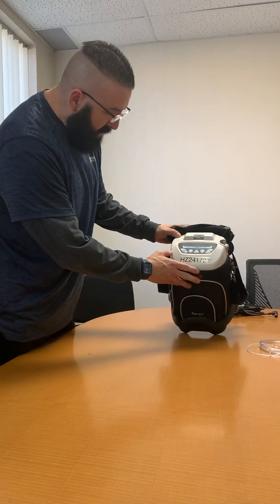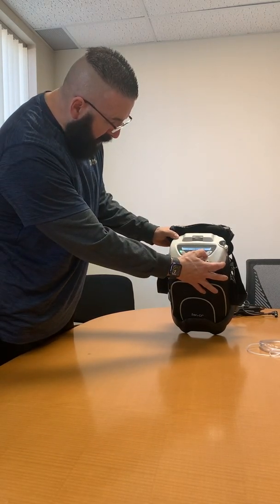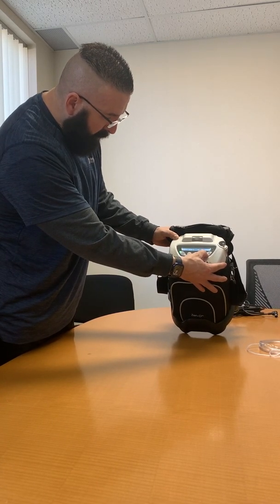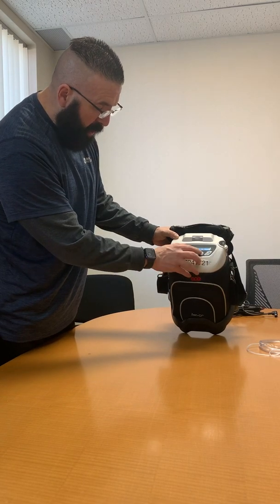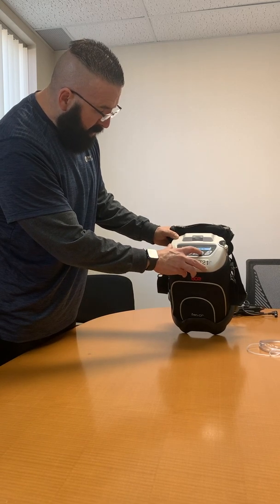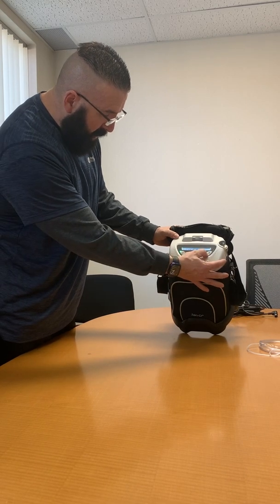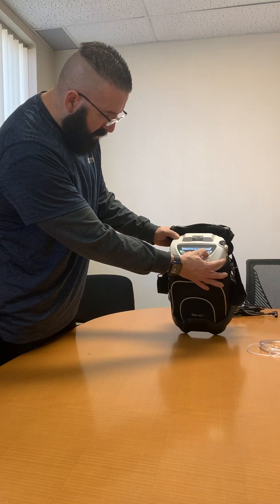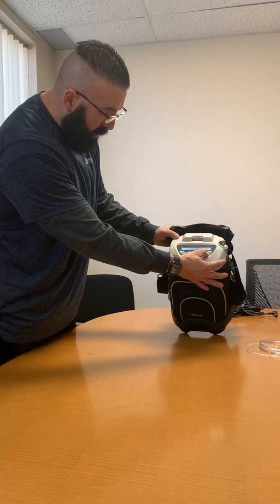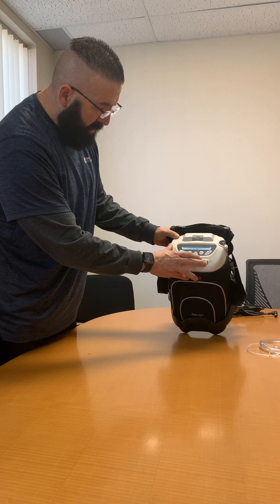Okay, once this starts up, there are two therapeutic modes on here. So right now we have the continuous mode lit up, which goes from 2 liters per minute all the way down to 0.5 liters per minute, and you're going to use the plus and the minus button to get to that. If you would like to get to the pulse mode, you're just going to press this button right here, and that is going to go all the way from 6 in 0.5 increments all the way down to 1 liter per minute. Again, two therapeutic modes on here, pulse and continuous.